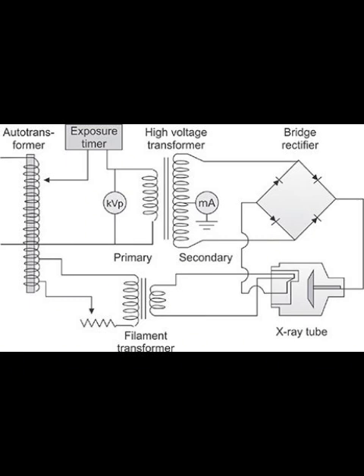This is the low voltage side of the X-ray circuit. It's where everything begins, coming from the main power supply. A wall plug, essentially. Basically, yes. Though it might be a higher voltage supply for big machines, its key components, kind of in sequence, are fascinating. You've got the main power switch, obviously. Then a circuit breaker, vital for safety, protects against overloads. Always need a breaker. Absolutely. Then comes the autotransformer. Our kVp selector. That's the one, providing that variable voltage we talked about. Then you have the timer circuit, which controls the exposure duration. And crucially, the primary side of the step-up transformer.